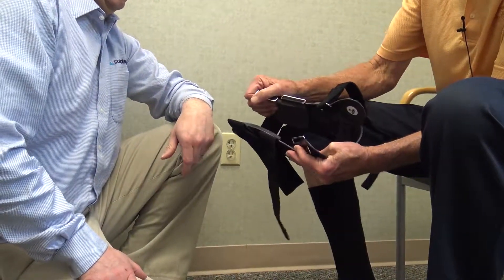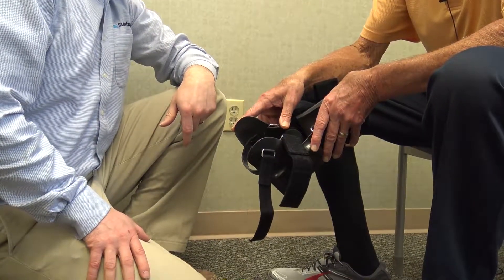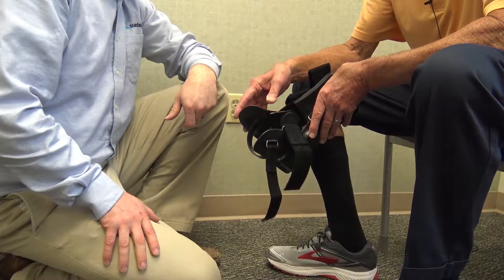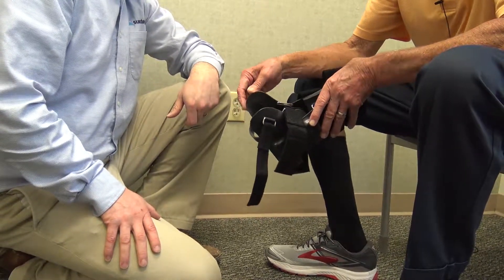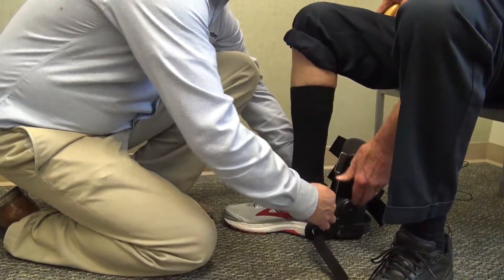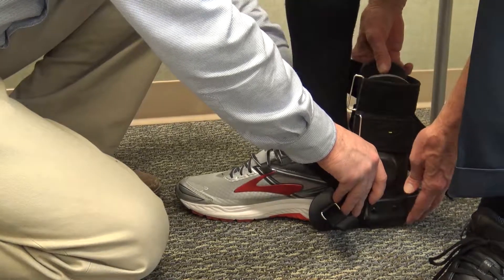Or you can bend it in. Sometimes, if it pinches a certain area, you may have to take a heat gun — it takes about 20 seconds. You heat it up for about seven to eight seconds, let it cool for five seconds, and then just take your finger and you can bend it out. He's already had it on once, then took it off and readjusted one or both side struts.